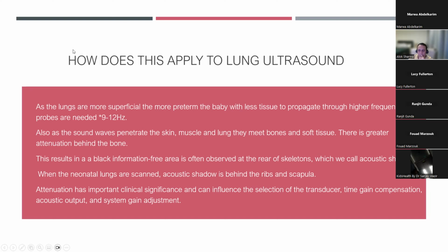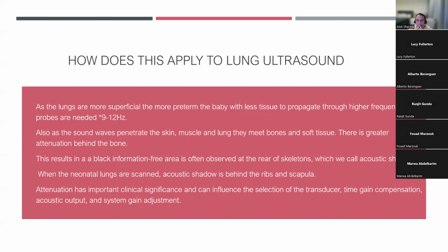Well, hello, Dr. Alok. I understand the concept of increasing the frequency to decrease the penetration and the reverse, but I just got confused. What does the focus have to do with this? Like most of our machines, we need to change the focus if we need to look at one sector with better quality. But if I change the focus, this means that I have to change the frequency of my probe. I just got confused with this.